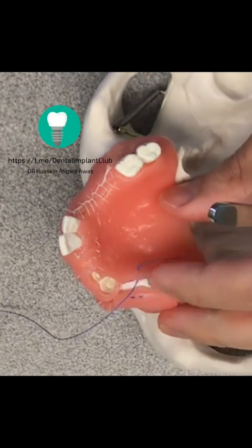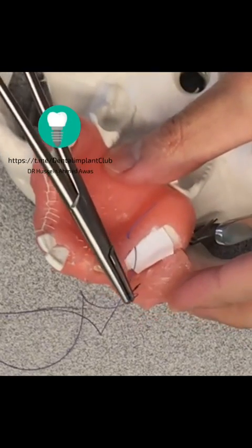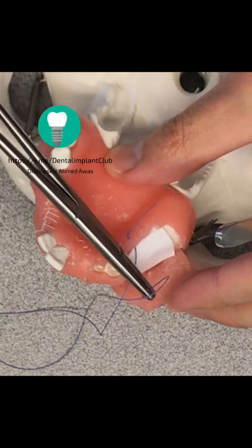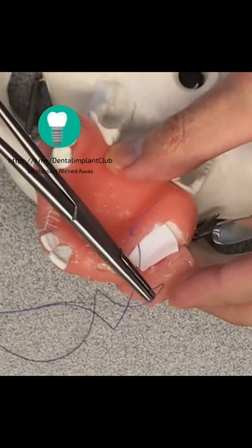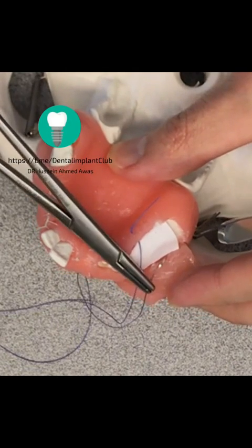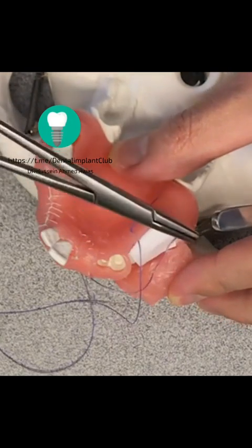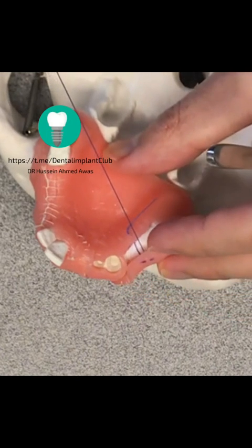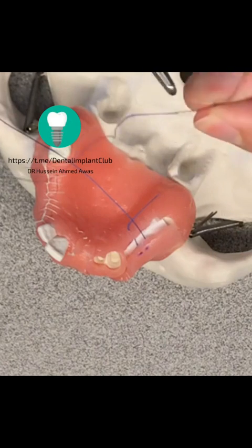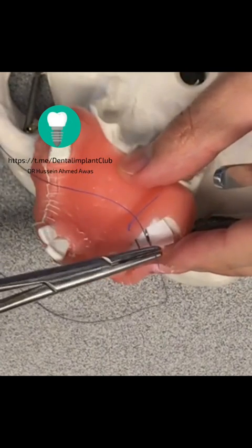Afterwards, we'll try to grab the periosteum and return to the palatal flap connective tissue.